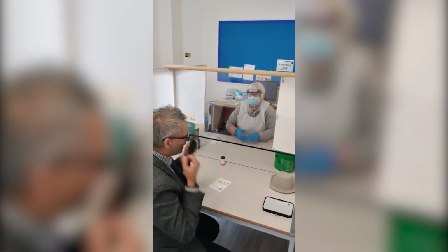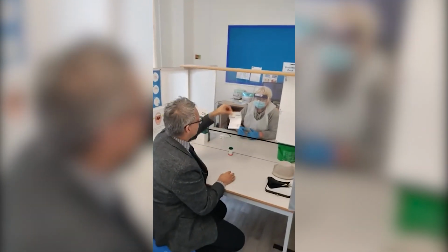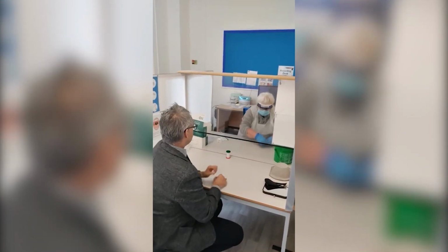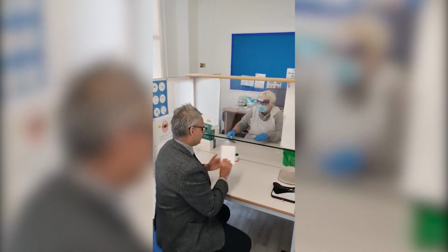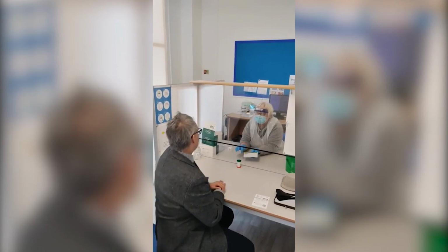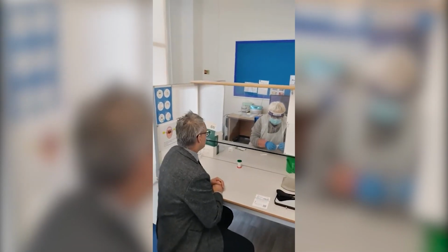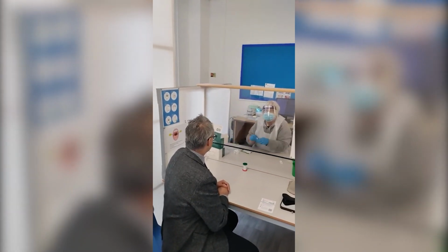Hi everyone, so here I am in testing bay 1. Welcome to our test centre. So you will have one of these registration cards with a barcode. So I'm just going to hand that over to Miss Brownsword. So can you just keep that for your record? Lovely. And this is the test that we use, so you can see it's still in date. Brilliant. So we've got over 4,000 tests ready for learners to come and take. It's a very quick process, isn't it, Mrs. Brownsword? It is very quick.